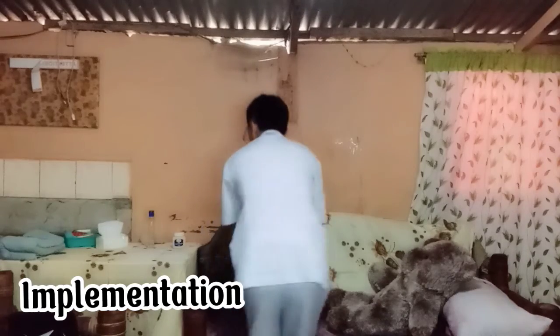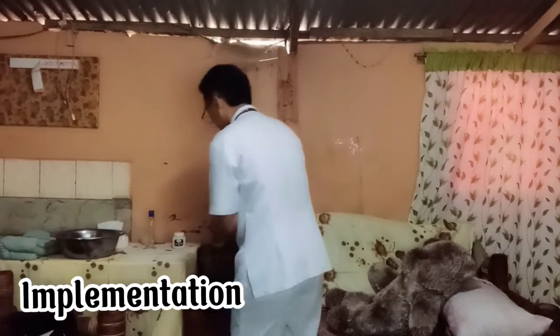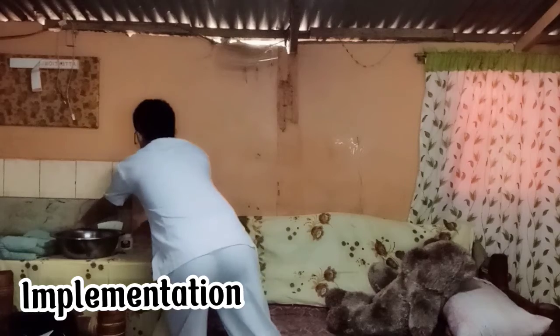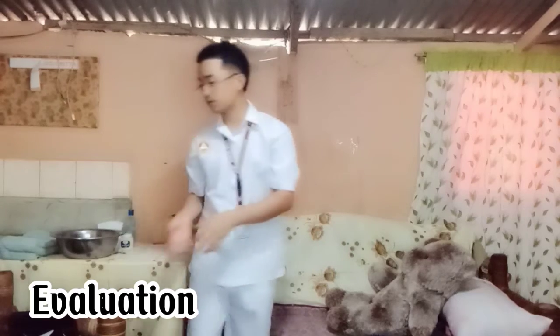Okay, so I'm going now to remove this. Then I'm going to discard and clean all the materials. Then for our evaluation, document the procedure. We're going to document it.